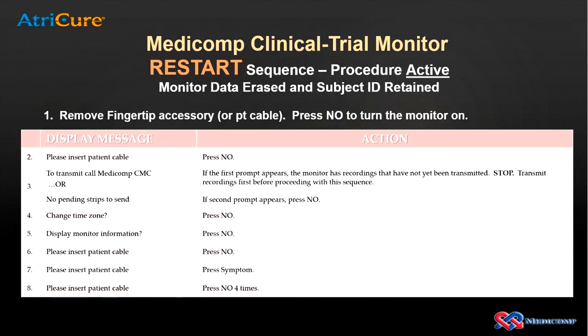Please note that the symptom-driven monitor has an operational limit of 184 days. Since the duration of this trial may exceed that, depending upon the subject's last recording window, you may need to restart the device before that time limit is reached. You can extend the limit by another 184 days at any time while the monitor procedure is still active, which is the easiest sequence, or when it has completed, which requires a few more steps.